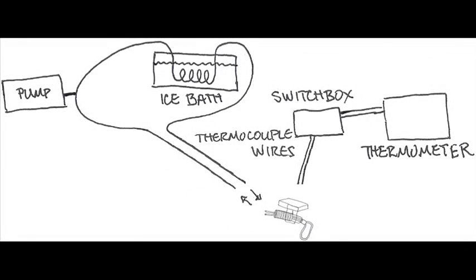After implantation of a cryoloop and during experimentation, the cryoloop is hooked up to Teflon tubing that enters a dry ice bath to cool the methanol. The thermocouple connector is connected to a switch box and a thermometer so cryoloop temperature can be monitored.